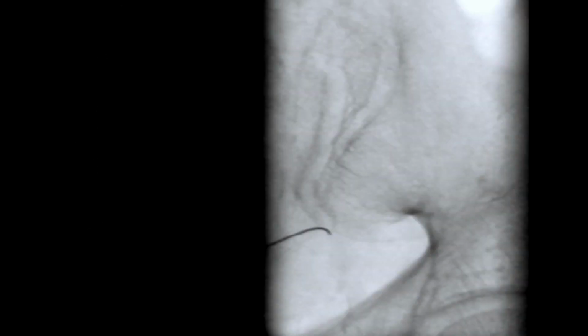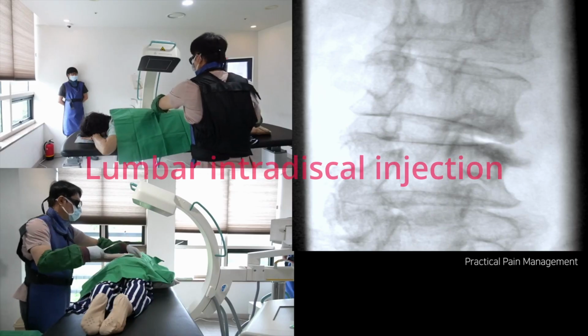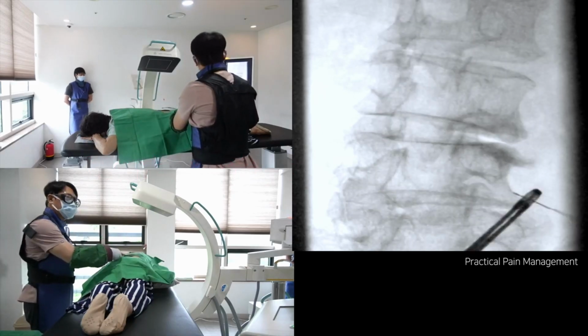After the needle tip is properly positioned, its placement is confirmed under continuous fluoroscopy, moving the C-arm in right and left oblique directions. On dynamic fluoroscopy, the needle tip should stay within the joint line and not appear outside of it. If the needle tip seems to be on the bone, outside of the joint line, it is not correctly placed.